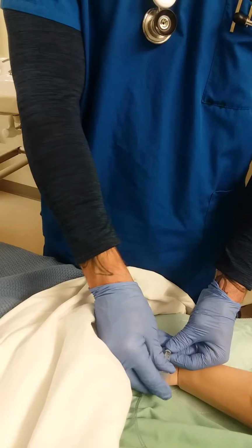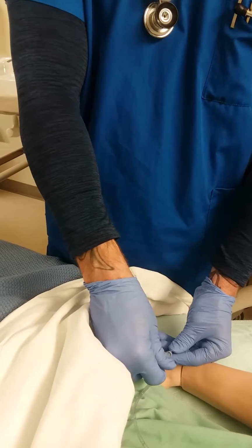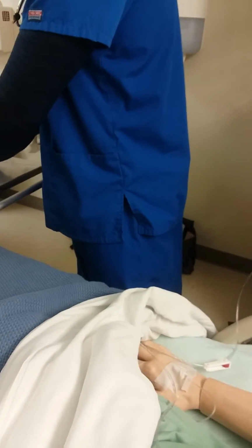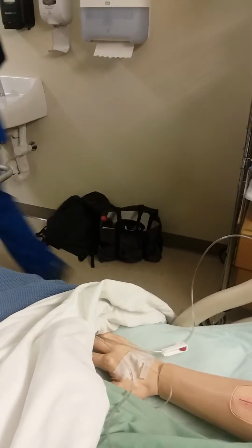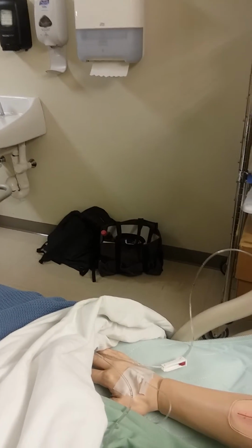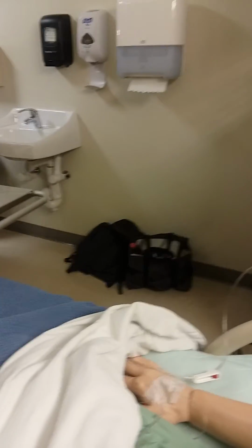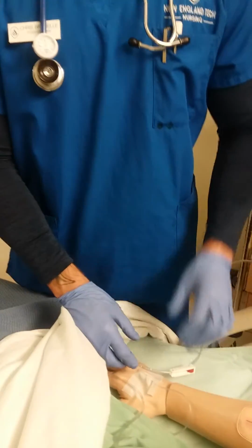So to save time, we'll say 60 seconds has elapsed. I'm releasing the tubing, and I'm unscrewing the syringe from the port. The syringe is going straight to the sharps container right now. So the tube's been released.